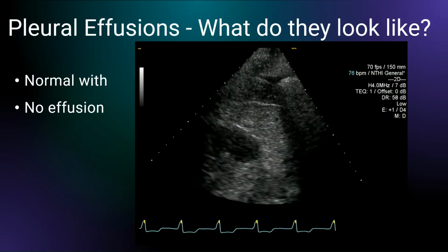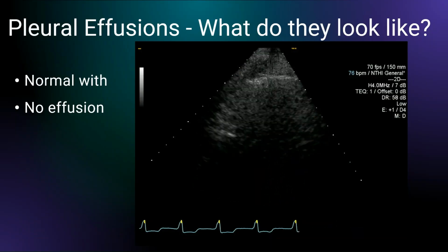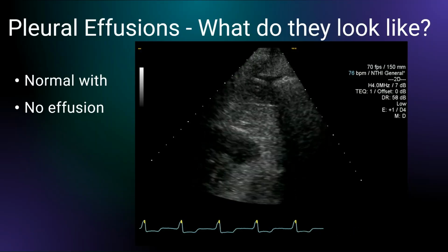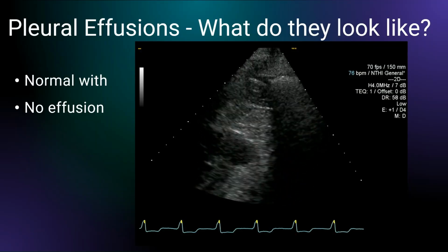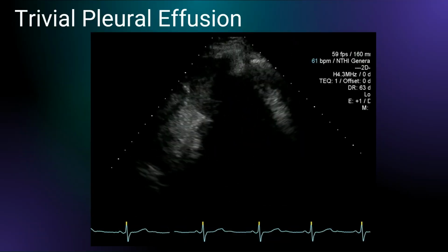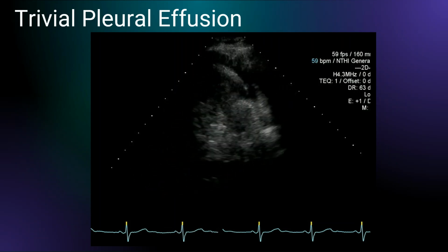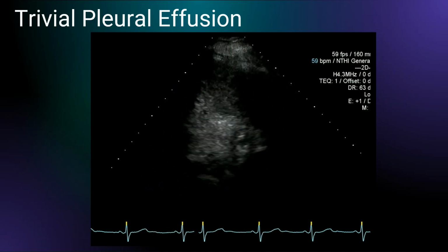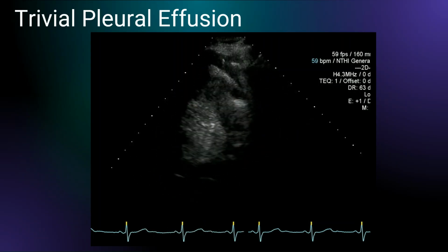And so here's a patient. There was no particular effusion to be seen. A little renal cyst, looks like it's over on the left there, you can see in the kidney, but no effusion to be seen on that one. This patient, as I take a breath in, you can actually see a little bit of fluid between the diaphragm and the actual lung there.